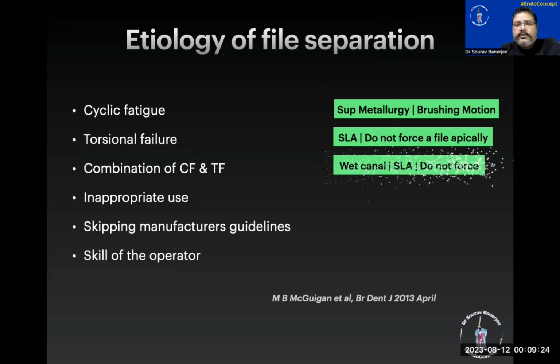Now, for a combination of cyclic fatigue and torsional failure, we have to avoid both of the things that we mentioned earlier. Second, we should always work in a wet canal, never in a dry canal, maintain a straight line axis, and again, do not force a file.